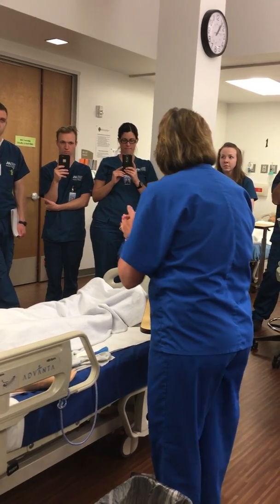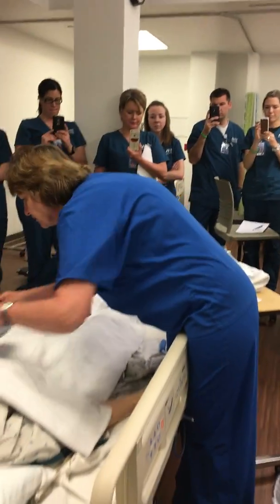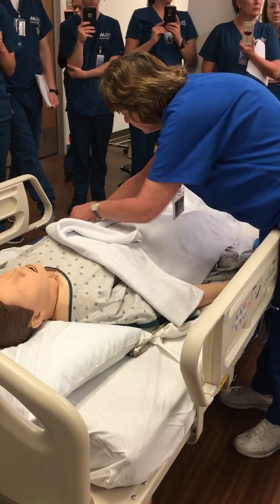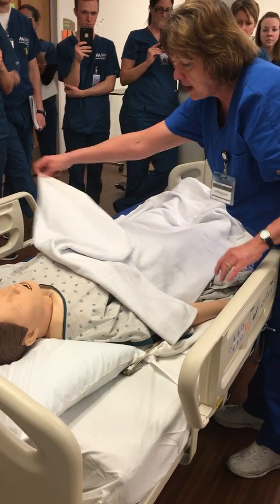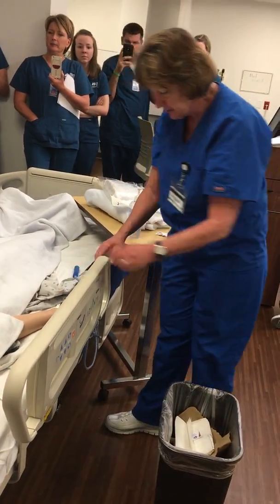We'll provide you guys with an order that has the whole catheter on it, and then I'm going to take my order and compare it. Can you tell me your first and last name? Stella Bellman. And your date of birth? 641. And do you have any allergies? No allergies. Are you allergic to betadine or shellfish? No. Then we can go ahead and get started.